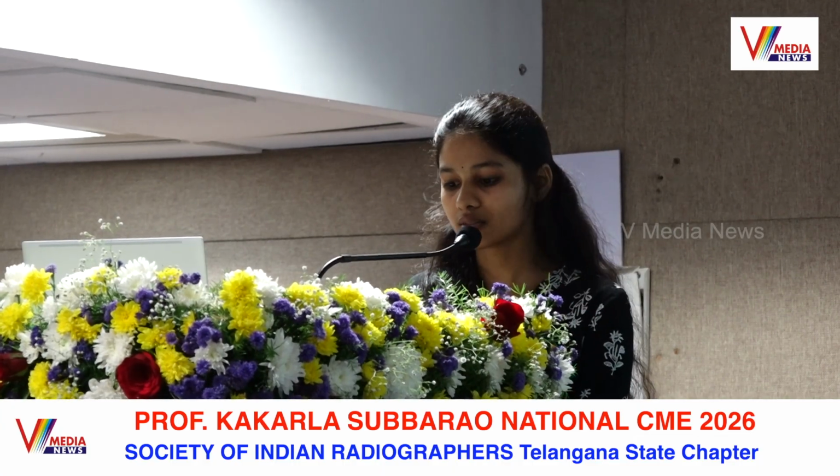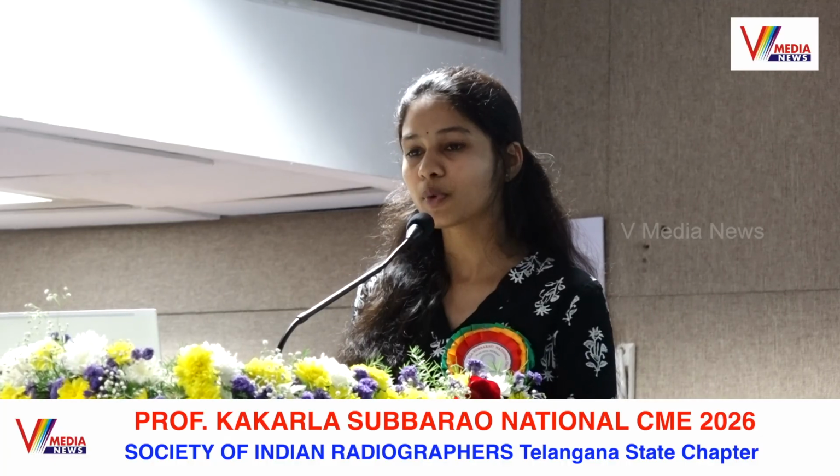Even though brain tumors are among the most serious intracranial pathologies, recent studies show that for around 6.4 per every 1 lakh people, there is a 33% mortality rate. So early diagnosis and treatment planning are important. MRI is the modality of choice because of its superior soft tissue contrast.